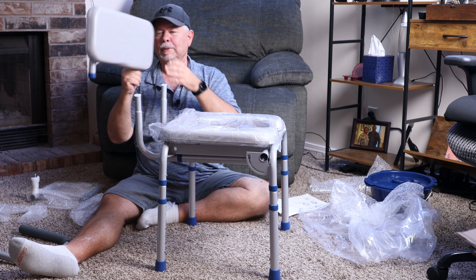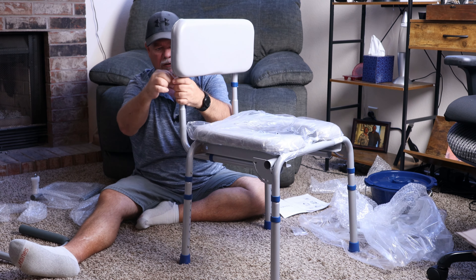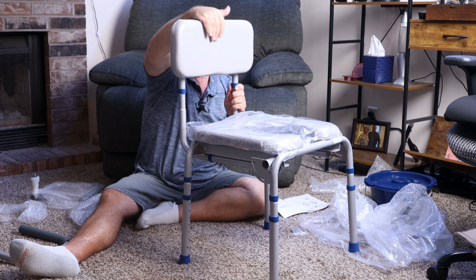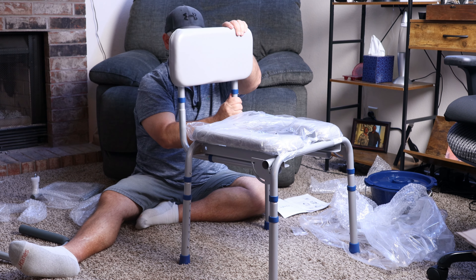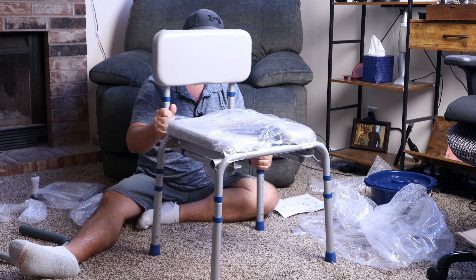Basically, that'll just put your backrest closer to the back of your toilet seat. We'll put our back on here now. Get that lined up, make sure you've got it straight. You might have to give it a little tap to get it to go, but it will go. Push your pins in, get that down a little bit, push that pin in, and it'll slide on down. There you go.